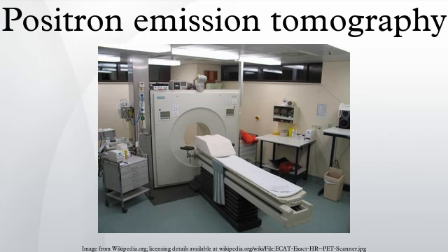Applications. PET is both a medical and research tool. It is used heavily in clinical oncology, and for clinical diagnosis of certain diffuse brain diseases such as those causing various types of dementias. PET is also an important research tool to map normal human brain and heart function, and support drug development. PET is also used in preclinical studies using animals, where it allows repeated investigations into the same subjects. This is particularly valuable in cancer research, as it results in an increase in the statistical quality of the data and substantially reduces the numbers of animals required for a given study.